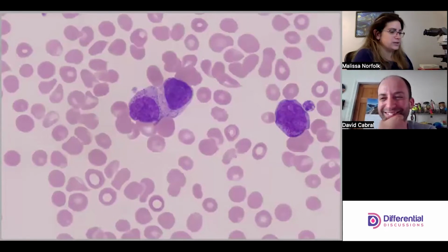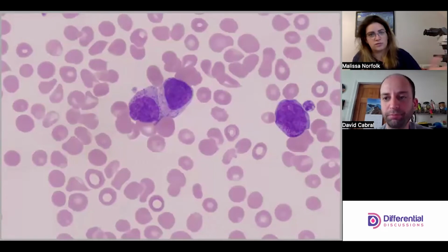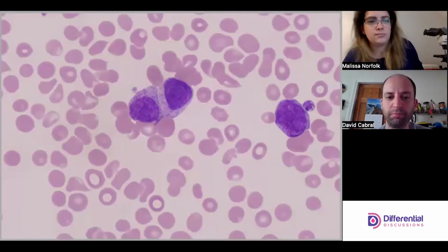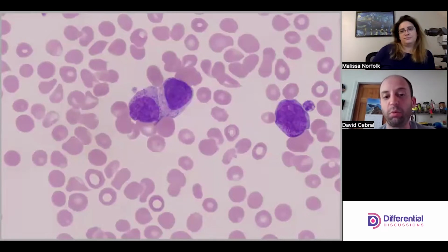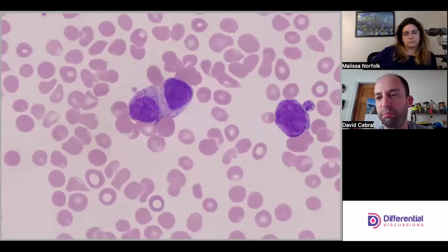So again, this one is under the WHO classification, not otherwise specified, M2. And some of the recurrent cytogenetic abnormalities look like this. You may see the full spectrum of neutrophilic maturation in some of the recurrent cytogenetic abnormalities, and of course under M2s. Generally speaking, morphologically, what we're expecting to see is everything: blasts, pros, myelos, metas. There's no real restriction here.